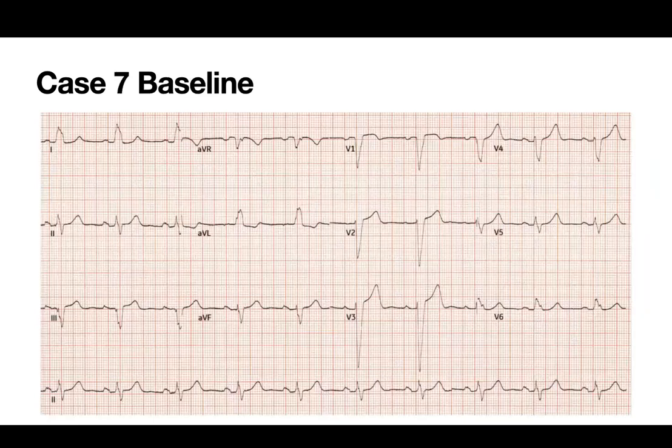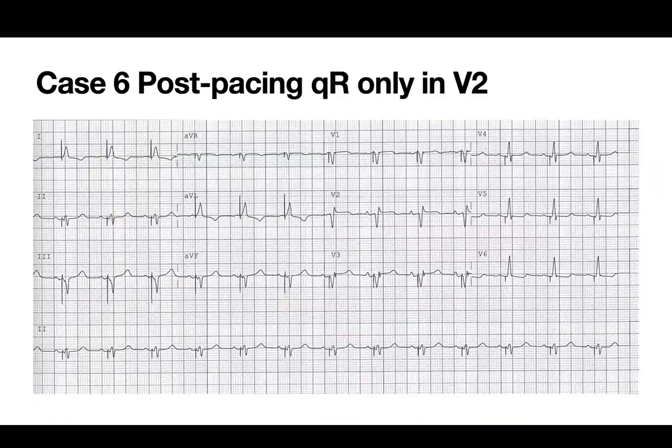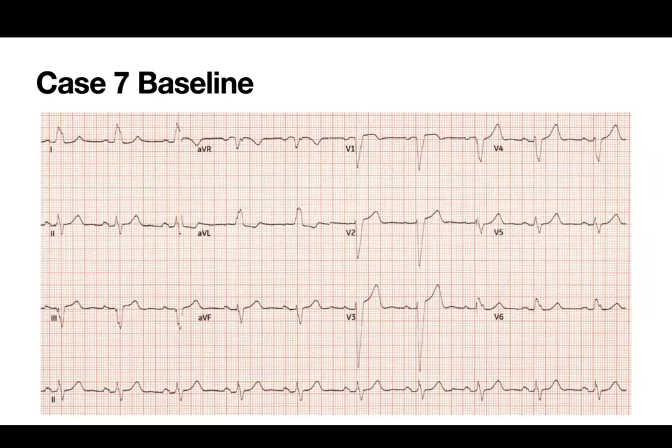To be honest, with the Medtronic system, we didn't have any issues slitting, but with the Biotronik one, because you have less length, you sweat a little bit more when you're slitting it. One time, in one of my first cases with the Biotronik, I dislodged the lead when I was slitting, but with the Medtronic, it hasn't happened yet.